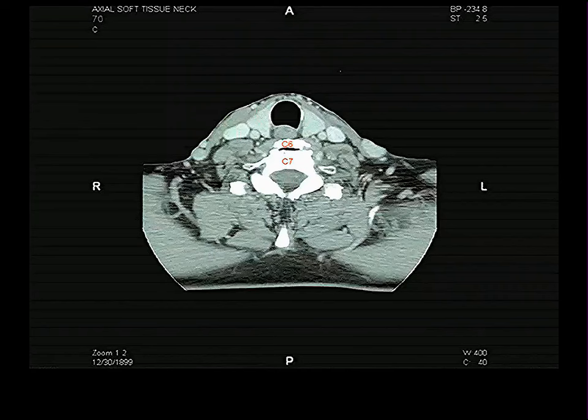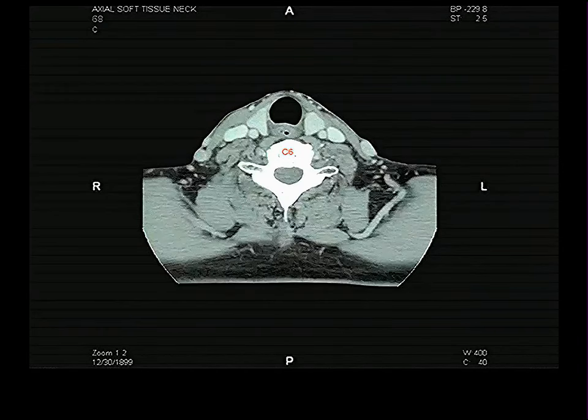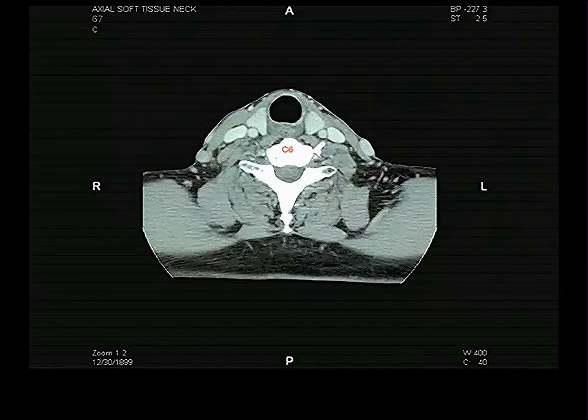Everybody's above average. All right. Yes, you're absolutely right. The actual cartilages of the trachea have calcified partially in this person. So we'll see little zones of calcified tracheal cartilage. As we go up higher, nothing very interesting. See some air in the person's esophagus. Go up higher. We're already superior to the isthmus of the thyroid now, but we're still at trachea. You can tell by that back wall, which is concave.